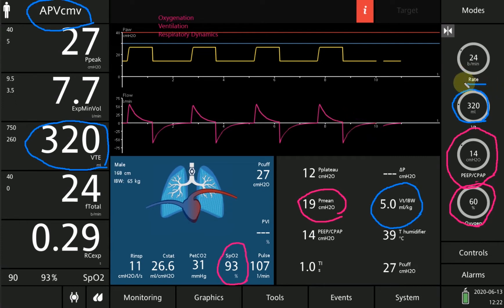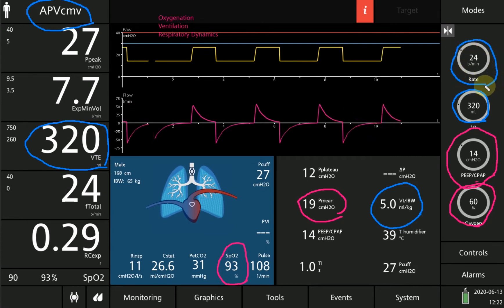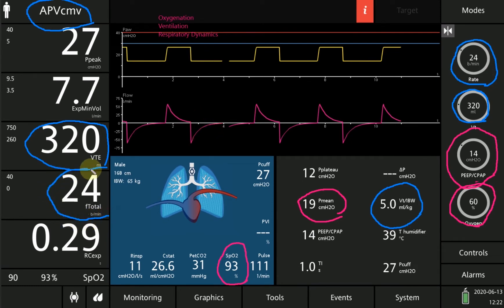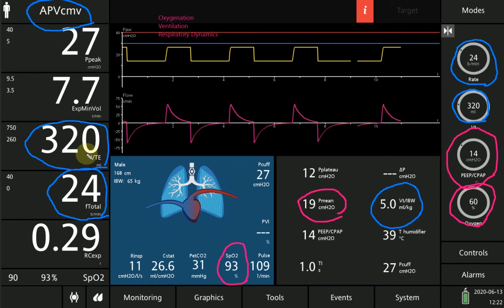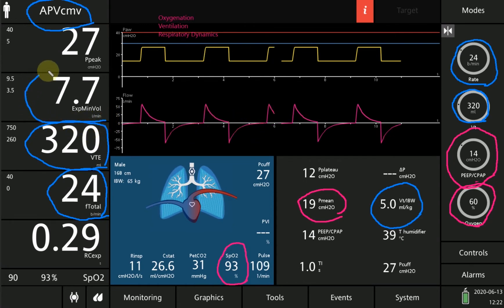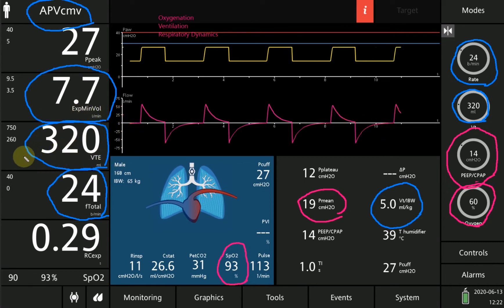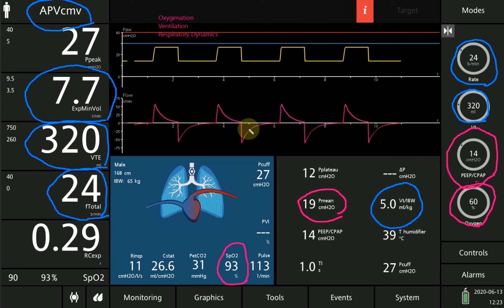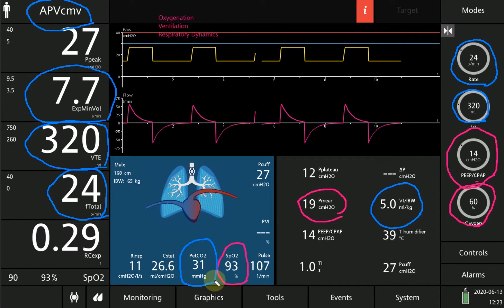The set rate is 24 breaths per minute and this patient is not breathing over the set rate. The settings are shown on the right side and what is happening with the patient is on the left side. The patient's expiratory minute ventilation is 7.7 liters, derived from expiratory tidal volume multiplied by respiratory rate. With this minute ventilation, end-tidal CO2 is at 31 mmHg, which is adequate for the patient's condition.